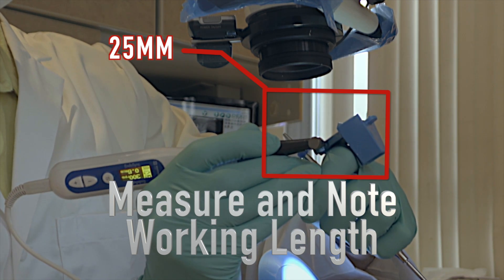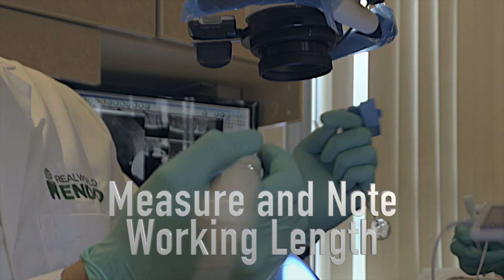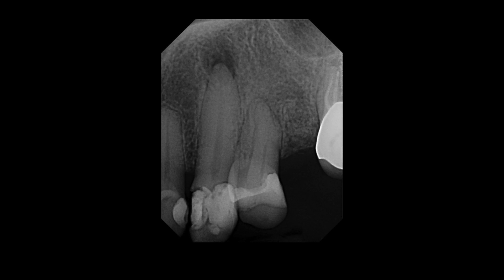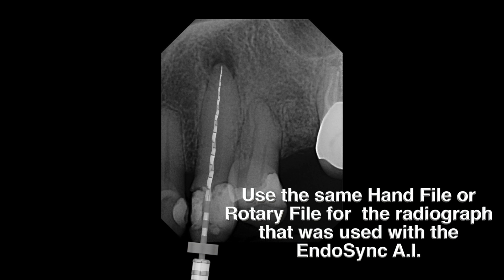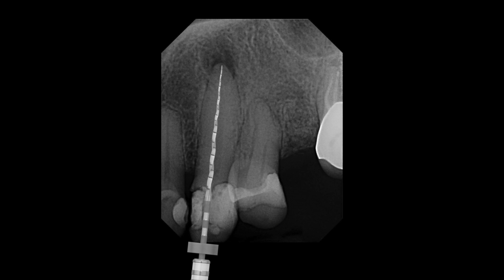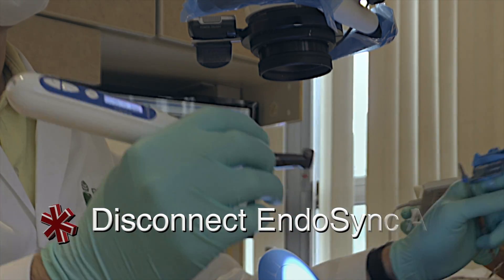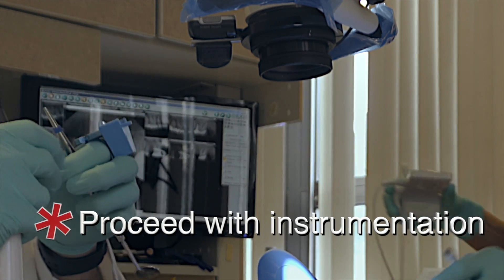At this point I measure the analog reading using my ruler — here we have a 25 millimeter working length. The file you use is usually the expediter or a couple of scout files. Don't forget that you need to confirm this with a radiograph, because we get additional information from a radiograph that you don't get from an apex locator — specifically the apical shape and diameter, which is almost as critical as the length itself. You can use your hand file or leave the same file in place and take a radiograph. Then you disconnect the handpiece and proceed to phase three, which is to complete the instrumentation with the ESX technique.